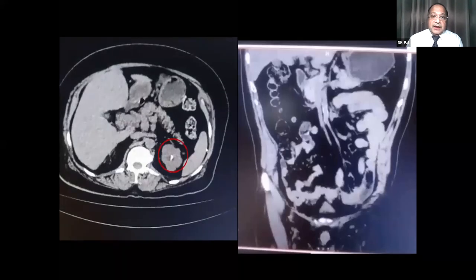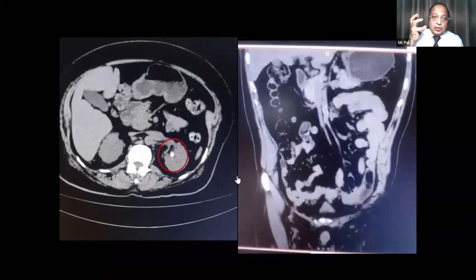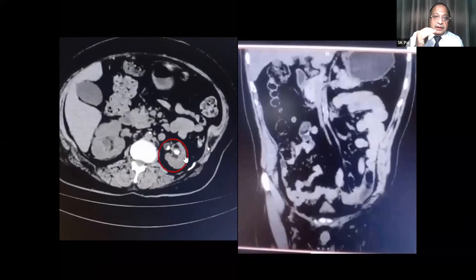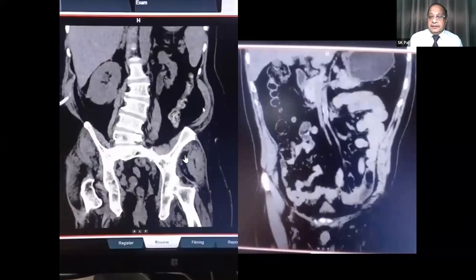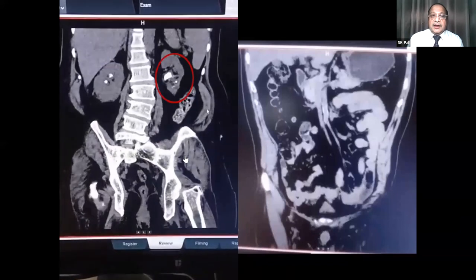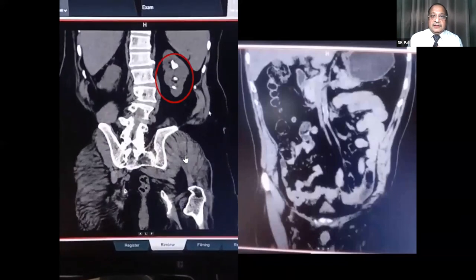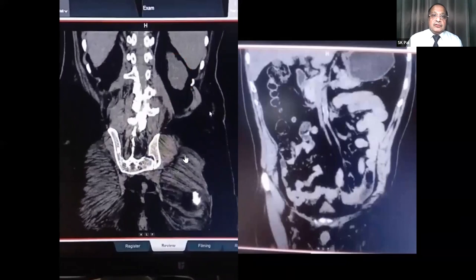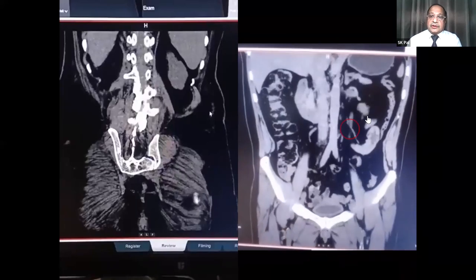There is a video, and you have to be really careful in studying the running video and then try to memorize this particular image of the stone. How when the kidney is being cut down, how the stone is spread inside the pelvicalyceal system. All that you have to study and memorize. This is not the static image which we got in this particular case. We are seeing the video and trying to memorize. And then during the surgery also, if there is any doubt, you will have to come to the video once again. But anyway, these videos give you so much information about the surrounding organs.